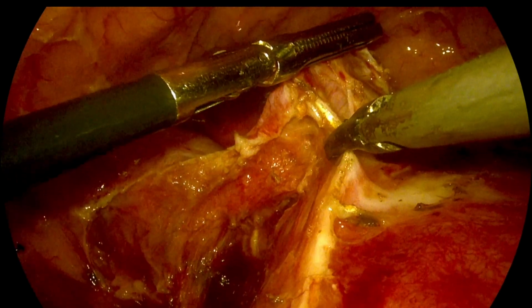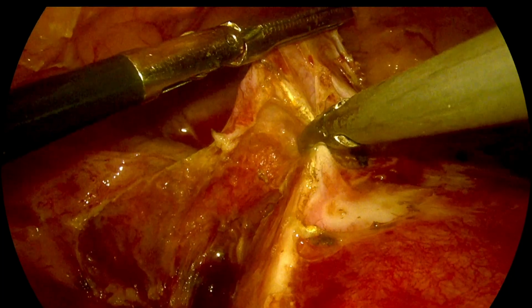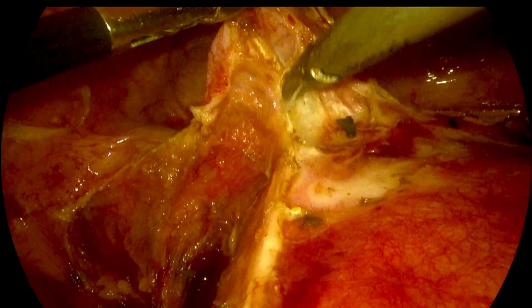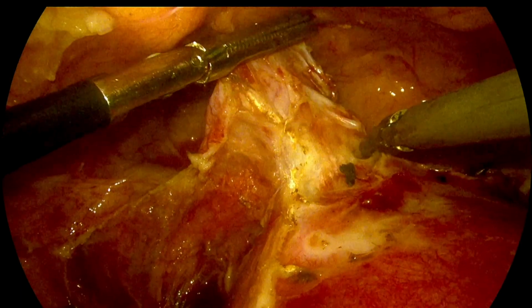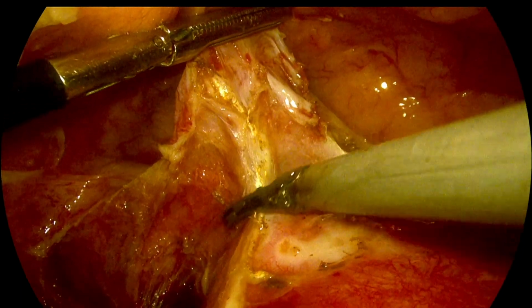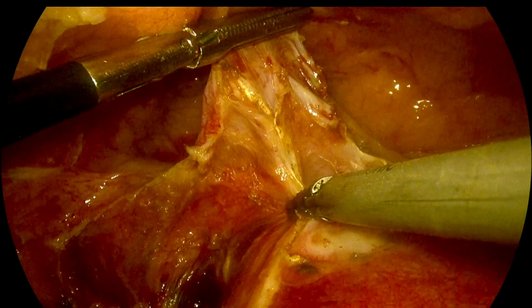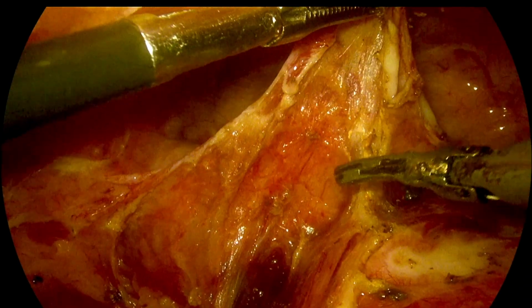So we continue the dissection from right to left side. The uterovesical fold of peritoneum, which was doubled up and folded back onto the anterior surface of the uterus, is divided completely. We are trying to separate the bladder from the cervix. And these are all fibrotic bands.